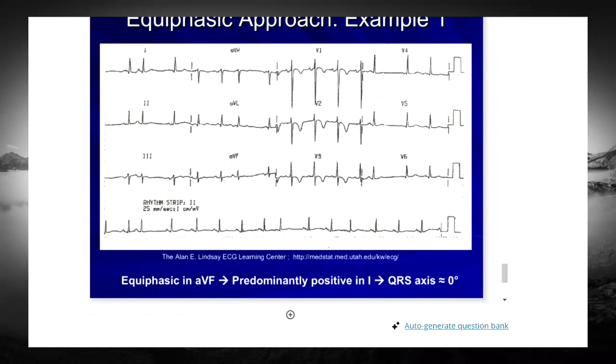All right. So if I am looking at an ECG and I want to make sure that this is a normal ECG, or that nothing is going wrong with it, I'm looking to make sure that the P wave's in the right place, the QRS, all those things look normal. I do that. Everything looks good. I then look for the axis of the impulse to make sure that the heart is situated correctly or that there are no blocks or anything in the conduction system.